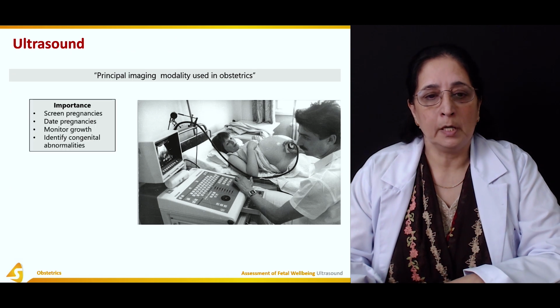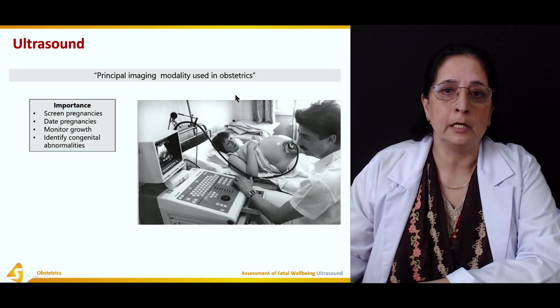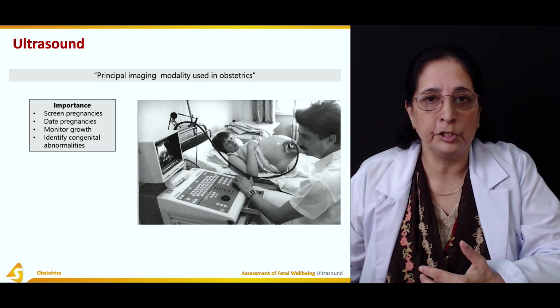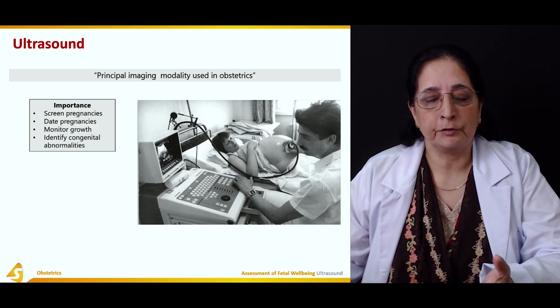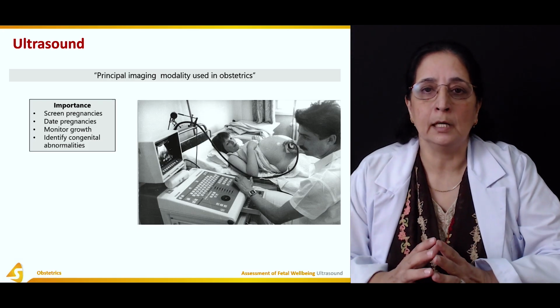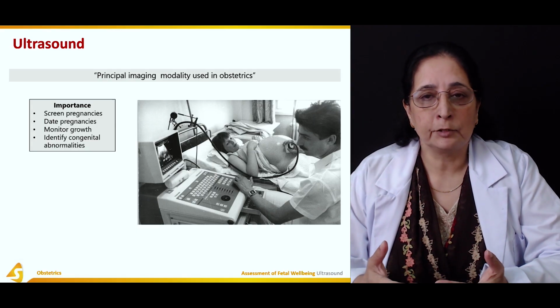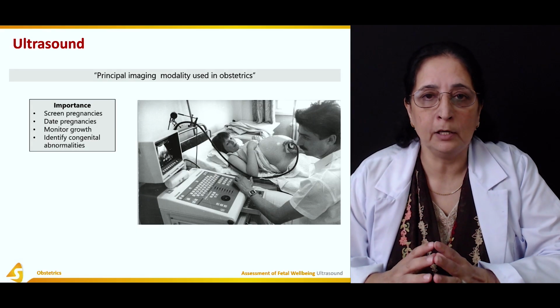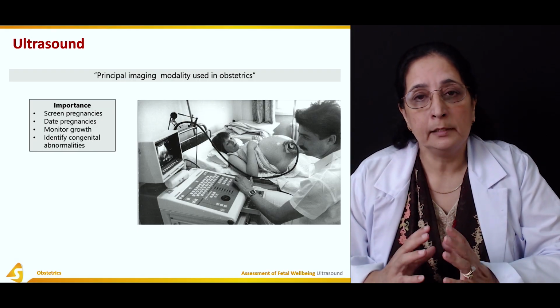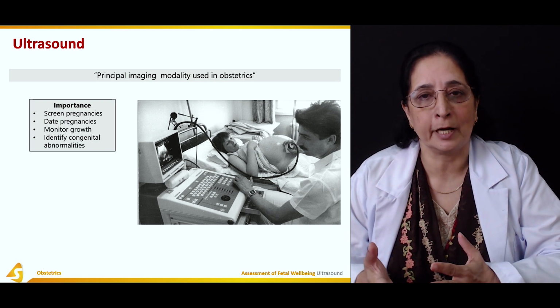Ultrasound is the principal imaging modality used in obstetrics. It's a very commonly performed procedure during pregnancy. The importance of using ultrasound in obstetrics is that it screens pregnancies. Screening of pregnancies is performed by ultrasound. Another very important function of ultrasound is dating the pregnancy.